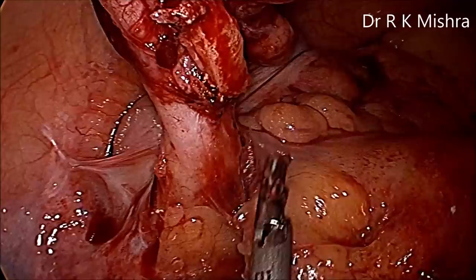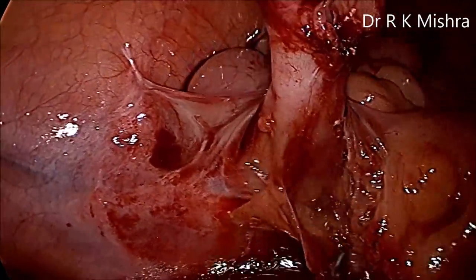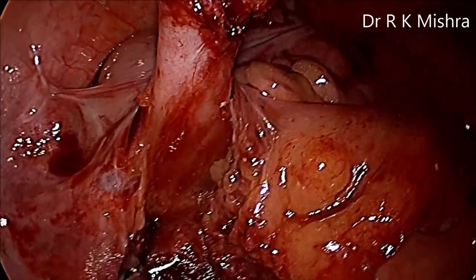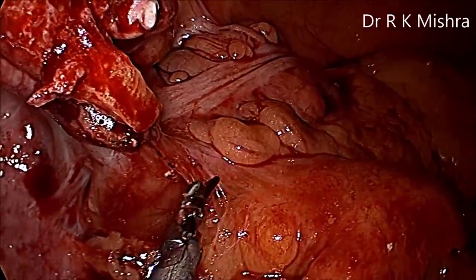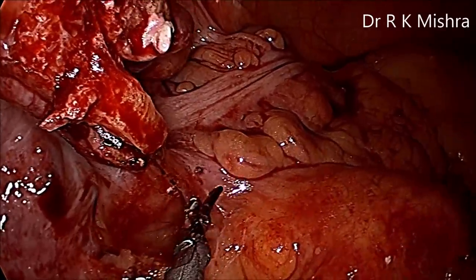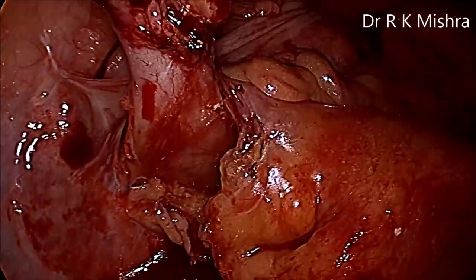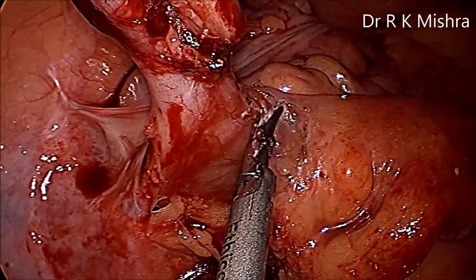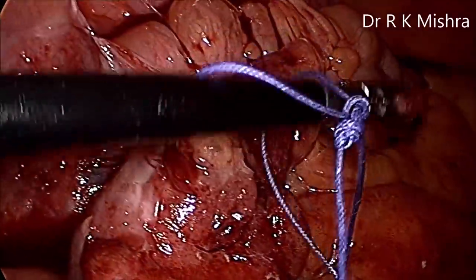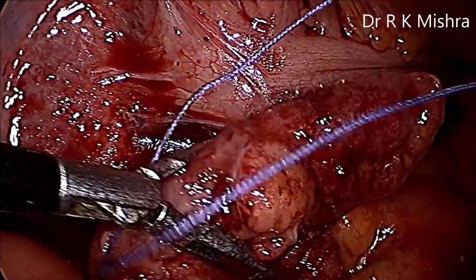And it's clear now. The base of the appendix is identified. After that you can use a simple extracorporeal Mishra's knot and apply it. So everything is clear. The inflamed appendix is up, but the base is absolutely fine. Good. And now this is a Mishra's knot. You can hold it and hang it over that.